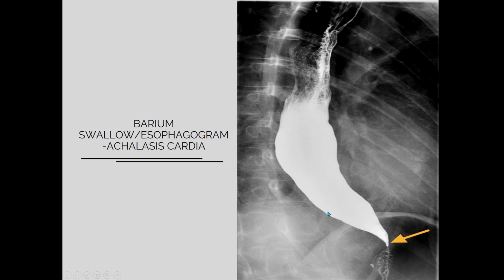Whenever you are studying barium, in practical life we cannot diagnose anything on a single X-ray. Whenever we are doing these barium studies, we make the diagnosis on multiple X-ray films. But naturally in your exam we are giving you a single film, so you have to decide on that single film with the finding. That's why you have to diagnose with only a single film.